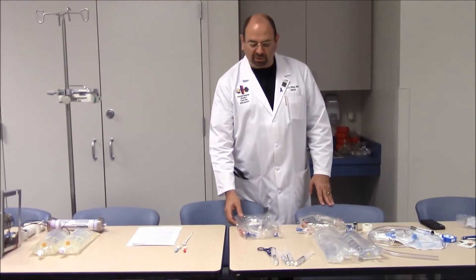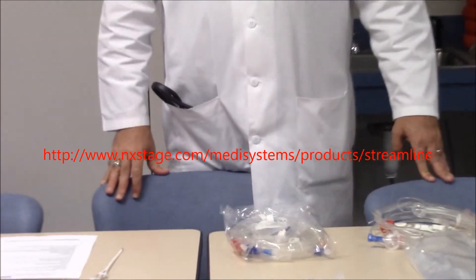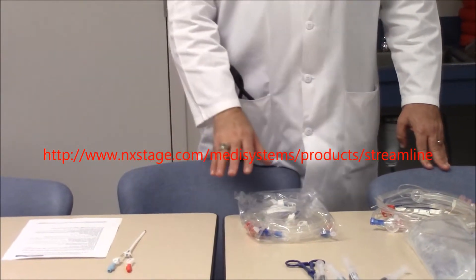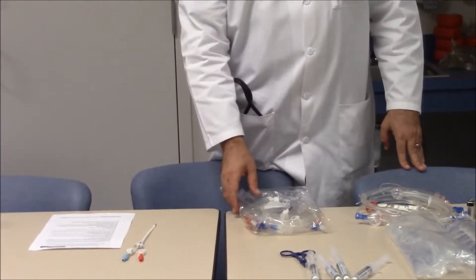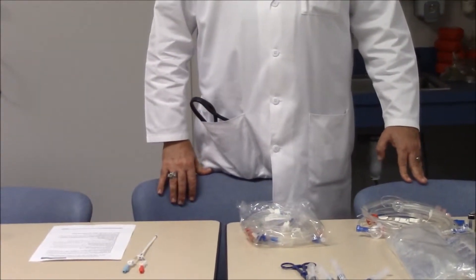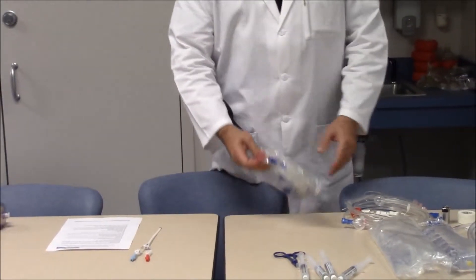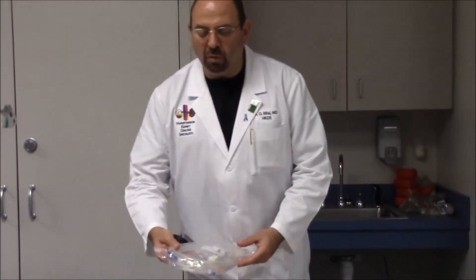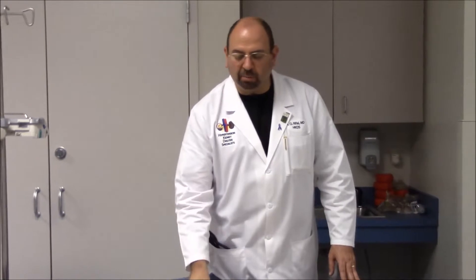The first item we need when collecting supplies for CVVH extracorporeal circulation is a set of tubing called the Streamline tubing. This tube set is made by NxStage — you can see the website address at the bottom of the screen. Each bag must be sealed; if it's open, it's no longer sterile, so do not use that set. This set has four major elements essential for the extracorporeal circulation.